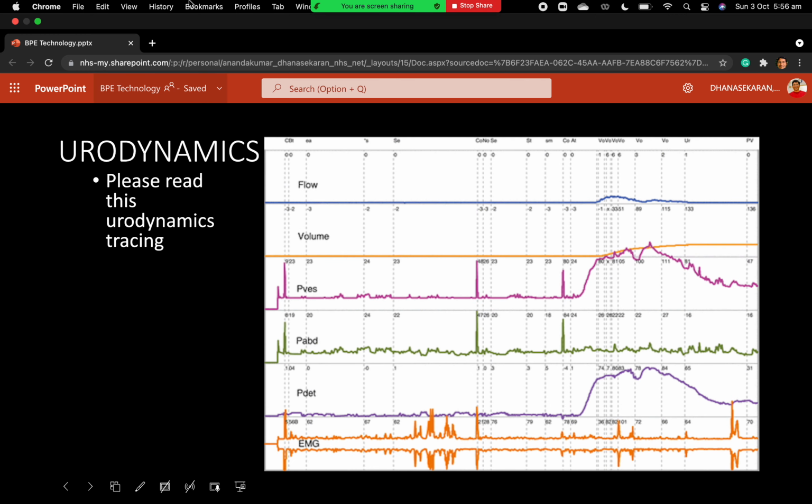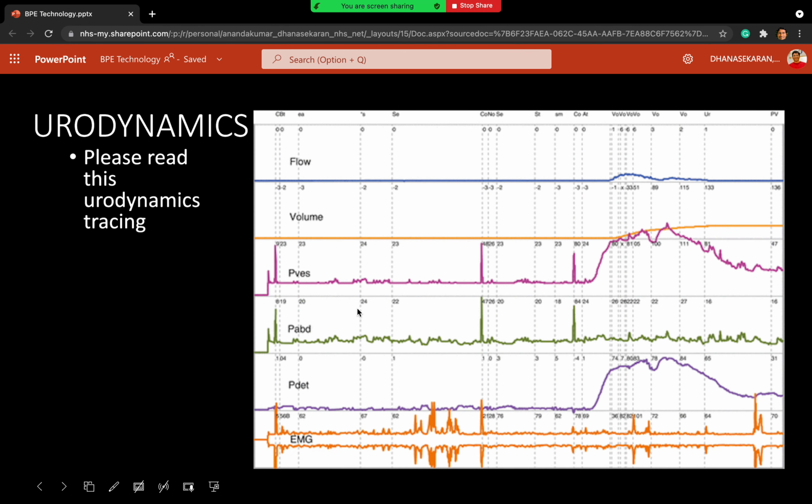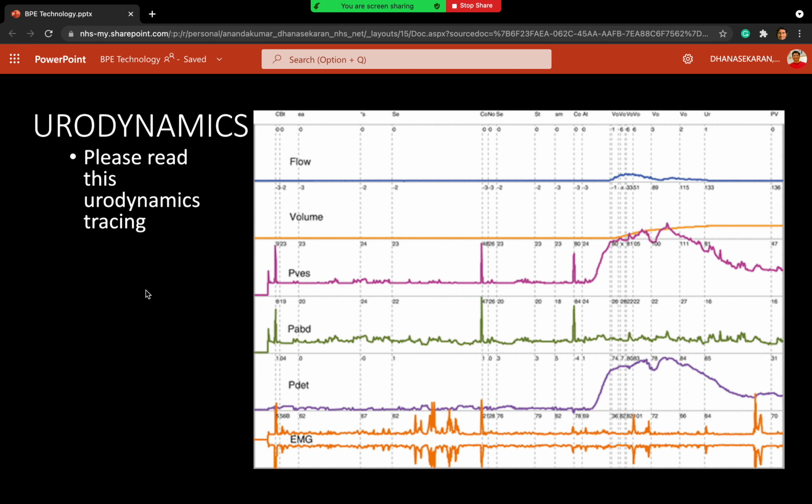of urethral and rectal lines in order to obtain pressure readings of the detrusor muscle in the filling and voiding phases. I'll explain that it takes approximately 30 minutes, and I'll outline the risks, including bleeding, UTI, the need for repeat tests, and dysuria. And I'll also ensure that the patient has the appropriate instructions prior to the tests, including cessation of any anticholinergics, beta-3 agonists, or prostatic medication, so as to gain an accurate result.